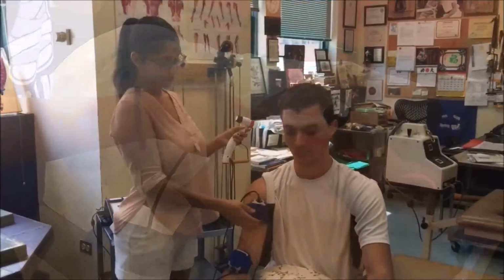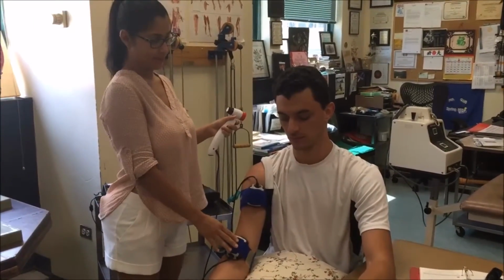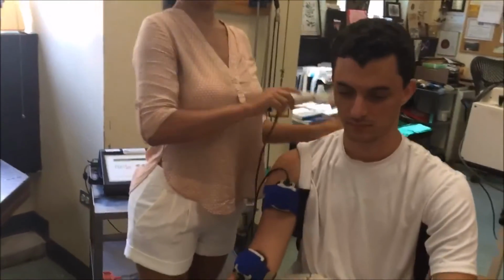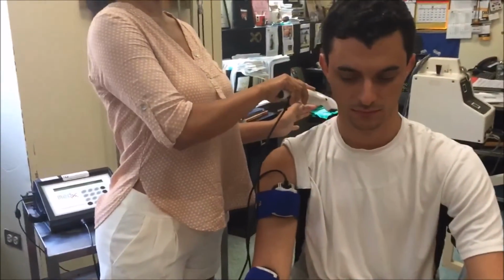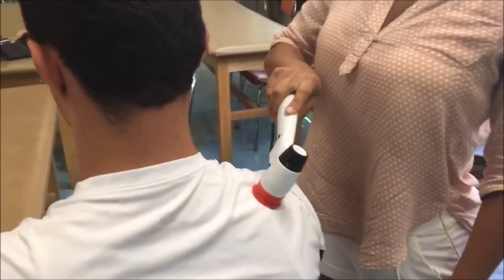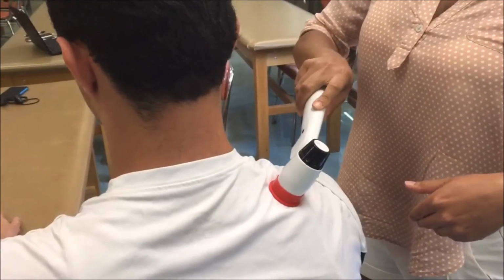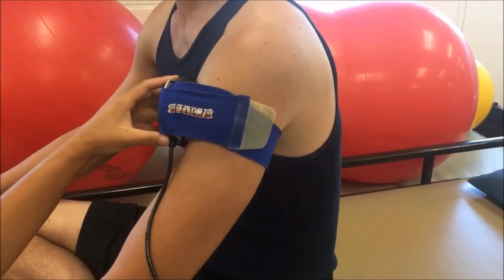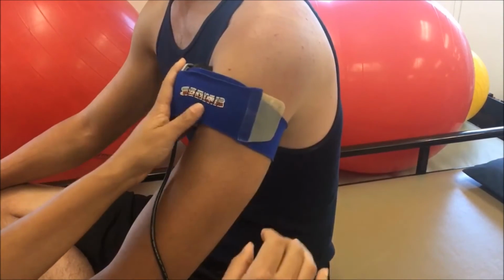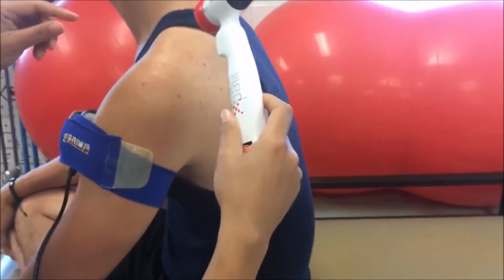This is the placement of the SLD for the biceps tendon, at the origin and the insertion of the biceps, and then you can place the laser in the area of pain, even up on the upper traps, assuming that the shirt is not on. For rotator cuff issues, you can place an SLD on the shoulder, on the anterior deltoid, and then you can treat the area of pain with the laser.